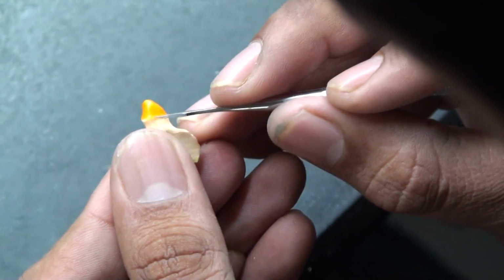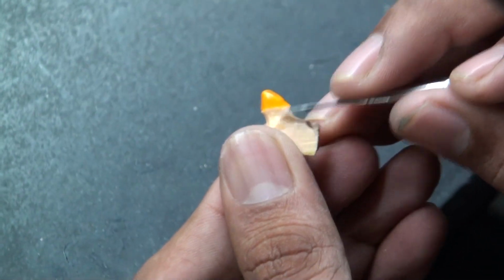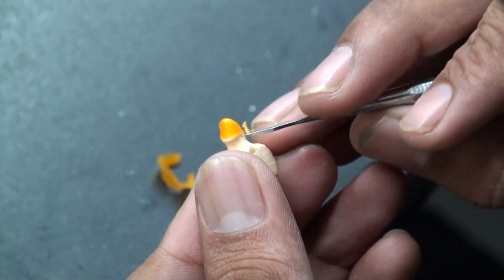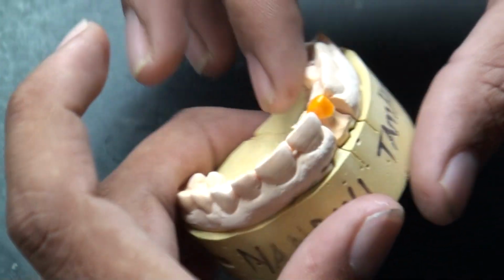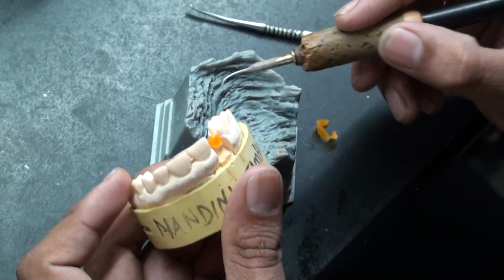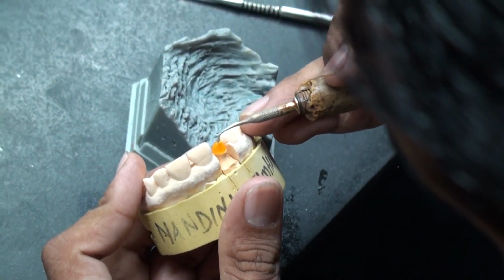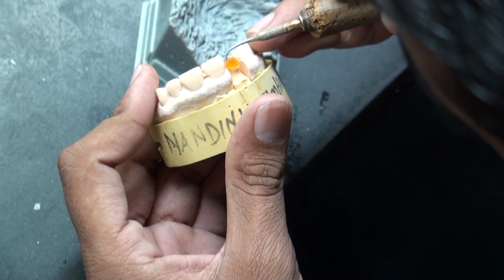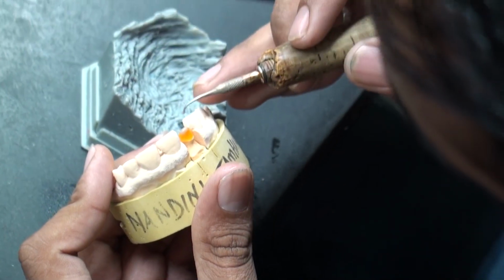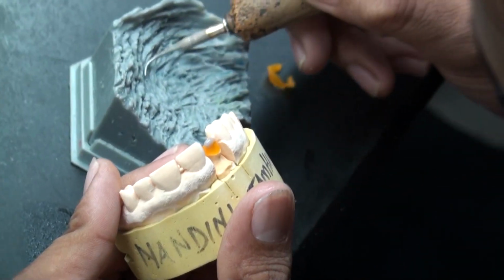And now you can see he's got a nice little coping. Now you can use that wax up for, depending on what you're doing. You can use it for metal coping, and you can cast it up. Now in this case we're using this as an Emax crown.